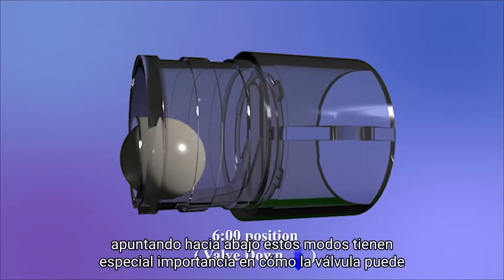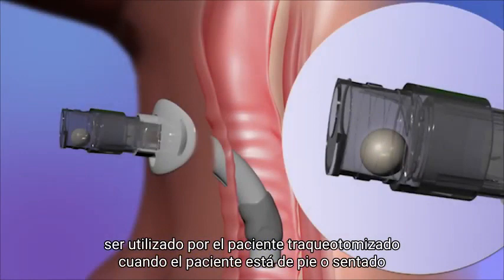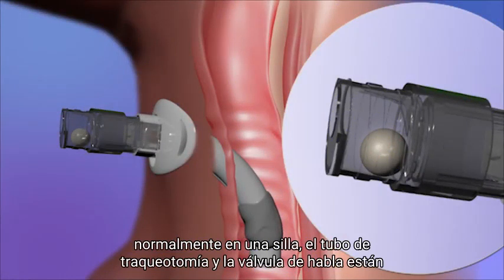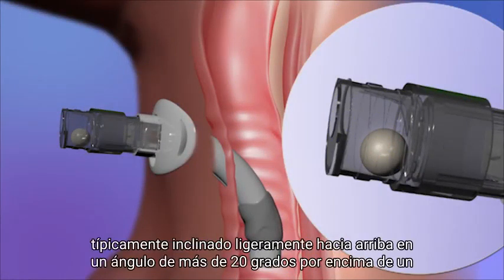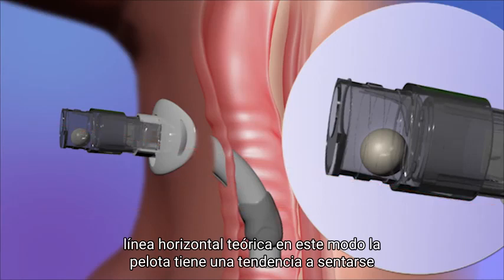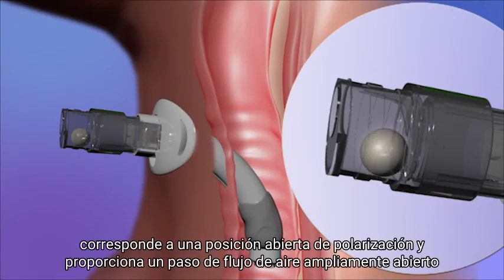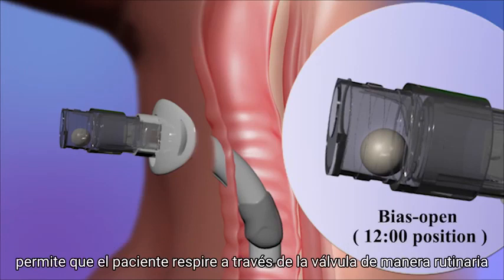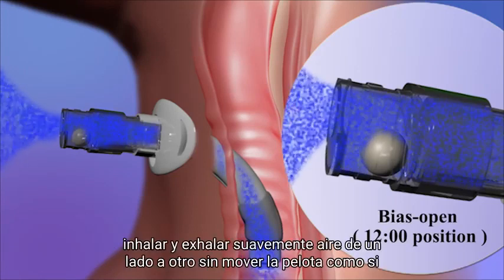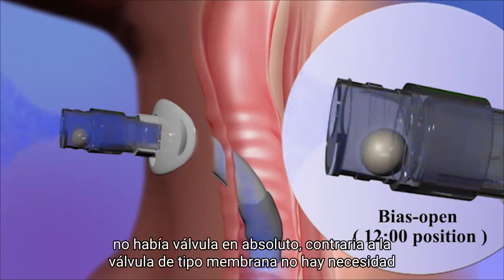These modes have special importance on how the valve can be used by the tracheotomized patient. When the patient is standing or sitting normally in a chair, the tracheotomy tube and the speaking valve are typically tilted slightly upward, at an angle of about plus 20 degrees above a theoretical horizontal line. In this mode, the ball has a tendency to sit posteriorly inside the chamber and away from the frontal opening. This corresponds to a bias open position and provides a widely open airflow passage that allows the patient to breathe through the valve in a routine manner, softly inhaling and exhaling air back and forth without moving the ball, as if there was no valve at all.